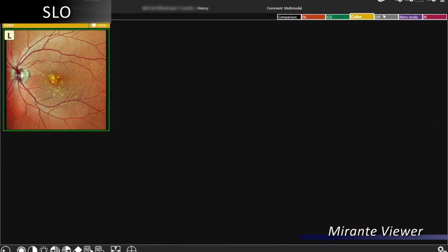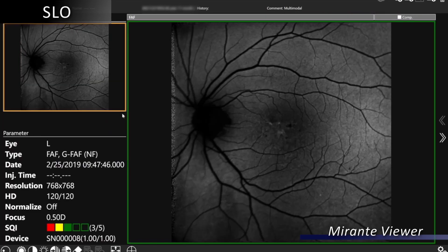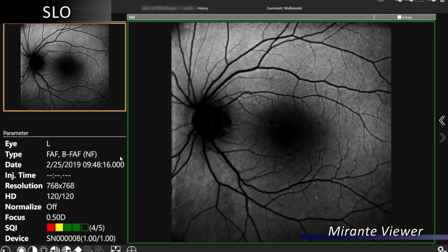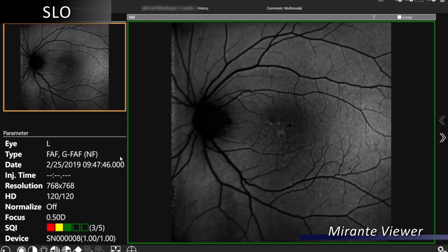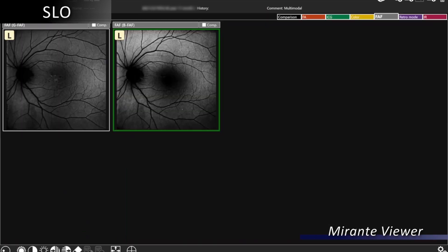Going back, we can look at a different modality such as fundus autofluorescence. This is green, which has less absorption in the macular pigment. Blue fundus autofluorescence has more absorption in the macular pigment, and we can scroll back and forth between blue and green to compare.